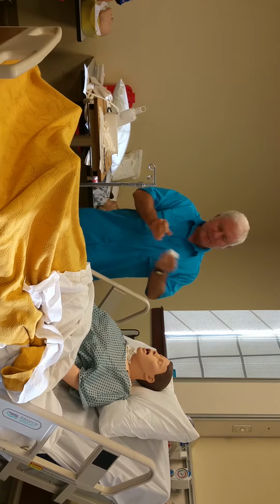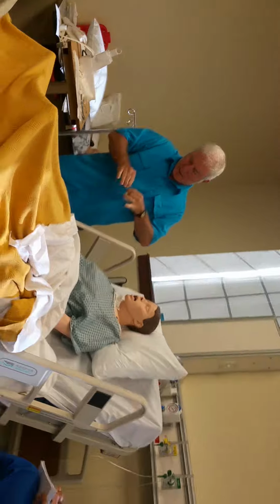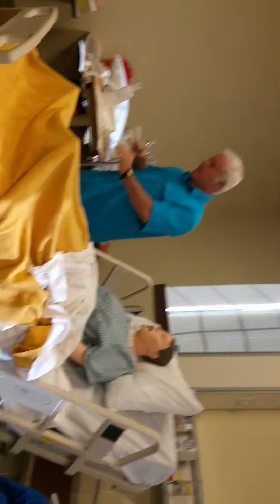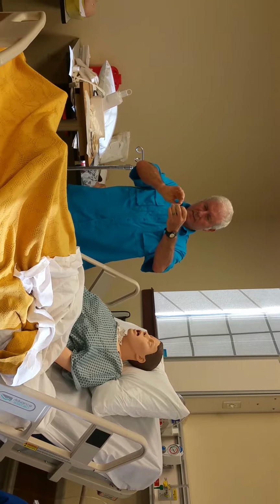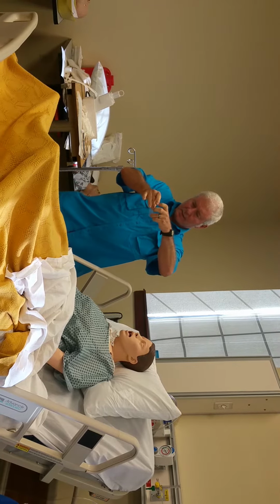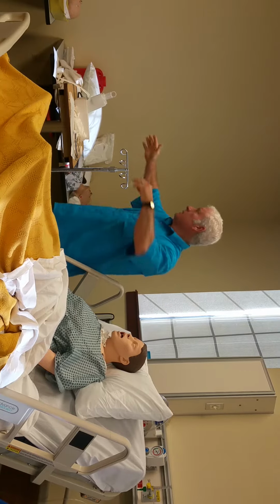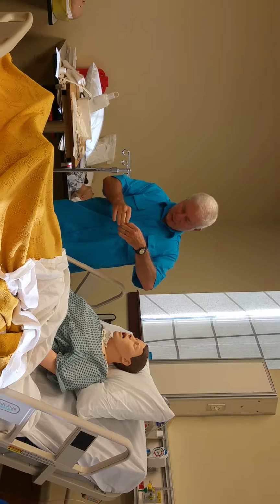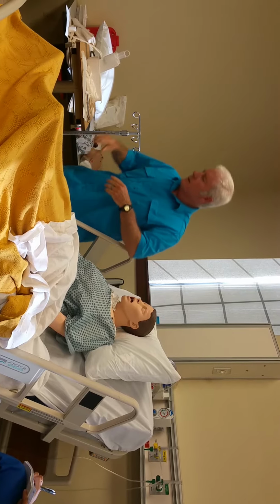ready. And this is the kind of tape I like to use for this. It's not too wide. You just need a couple inches, okay? And then I'm just going to tear it right up the middle, just like that. And I want to set it somewhere where I can reach it, because I'm going to be over here, so I don't have to move around a lot. So I'm just going to set it somewhere that I can reach it. I can actually reach it right there, okay?